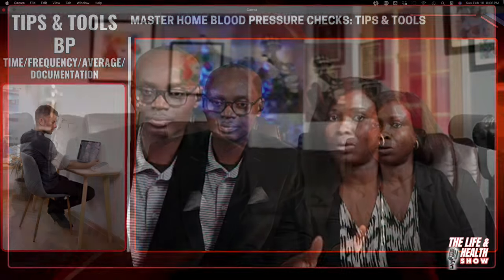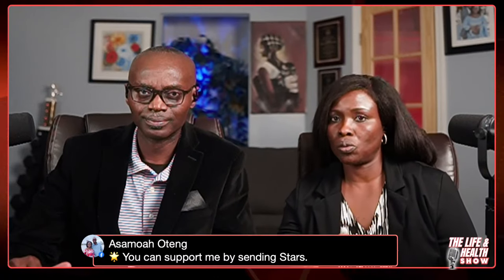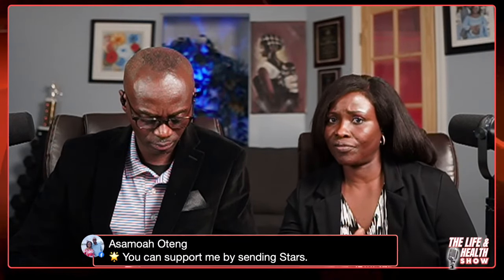Yeah, and with the frequency, I think it would depend on where you are. If you've been diagnosed already by your doctor as being hypertensive, or you've not been diagnosed, but you want to make sure that you don't get to that point. Depending on where you are will determine how frequently you check your blood pressure. I think the last time Dr. Nate recommended that if you don't have high blood pressure and you want to know, you can do it twice a year or maybe not frequently.